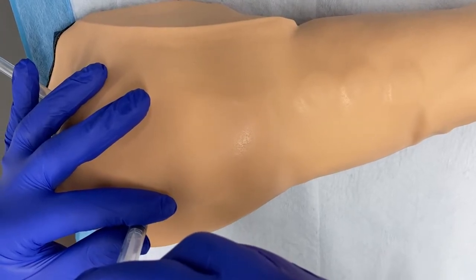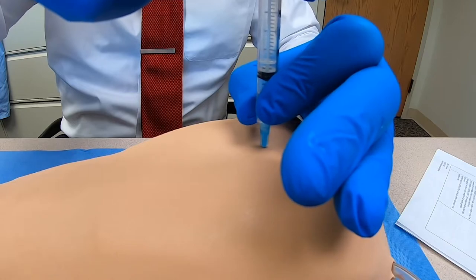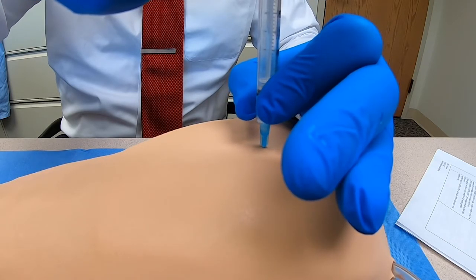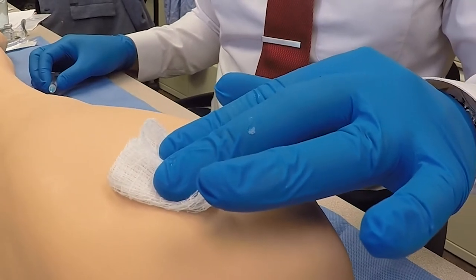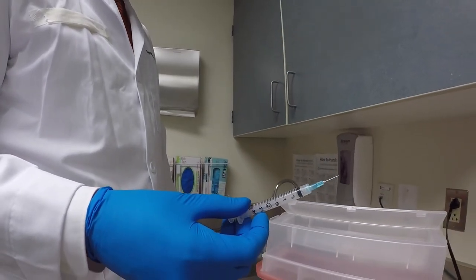Steady the syringe with your non-dominant hand. Inject the medication slowly at a rate of 10 seconds per ml. Draw the needle out at the same angle it was inserted and use a clean gauze or dry cotton wool ball to apply gentle pressure. Dispose of the needle and syringe in the sharps container.